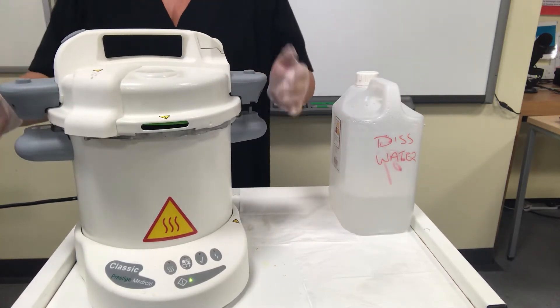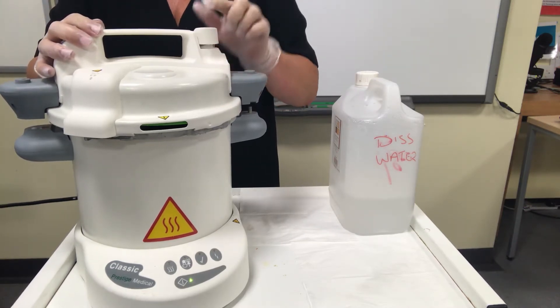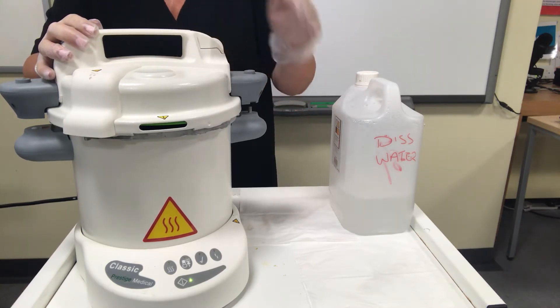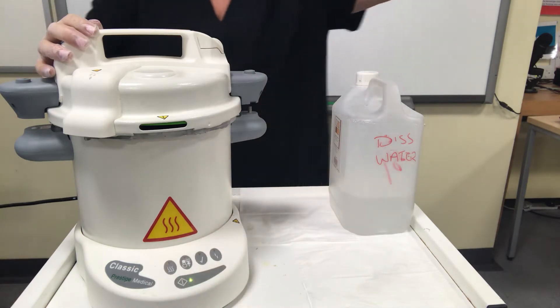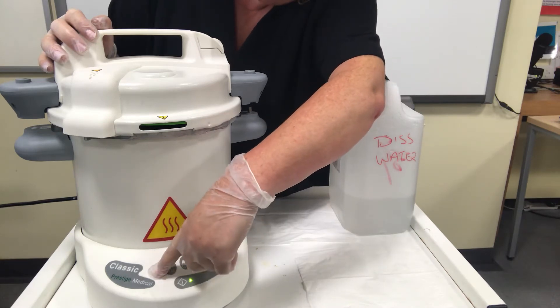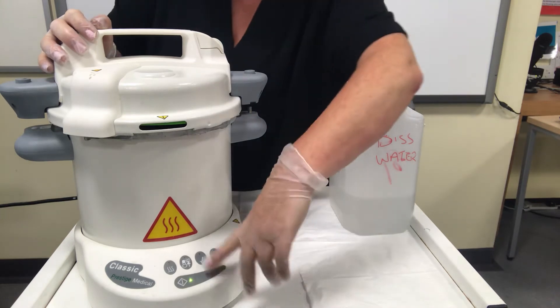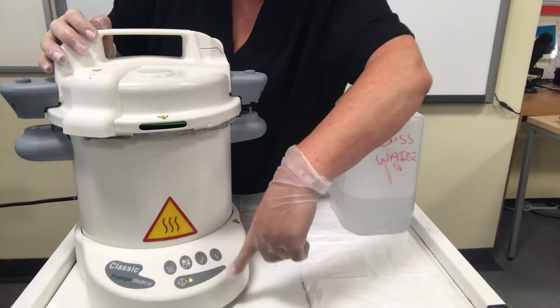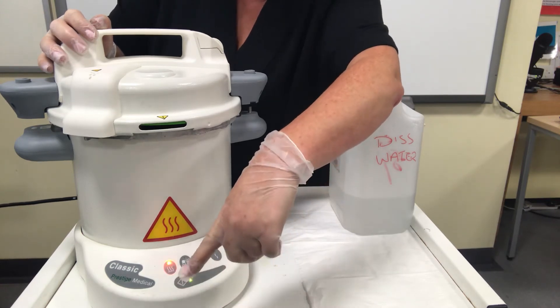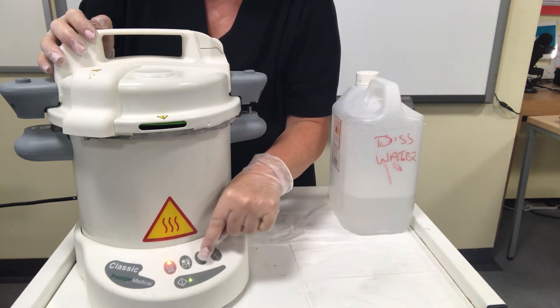Line up the handles — the handles must be lined up. There's a valve at the top that must be down, flush with the handle. On the front we've got some dials. You press the banana-shaped dial with a diamond on it and this starts the autoclave. The lights light up in succession.